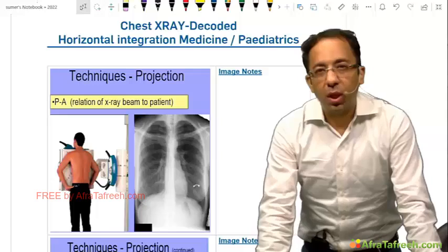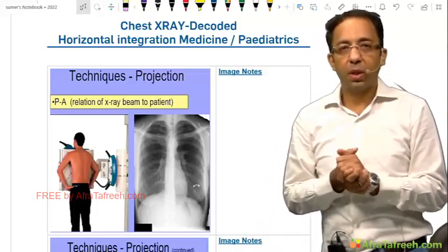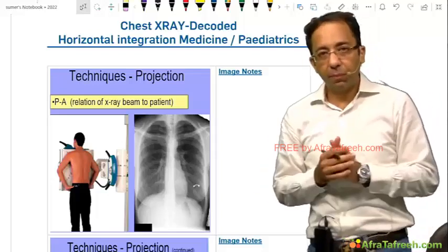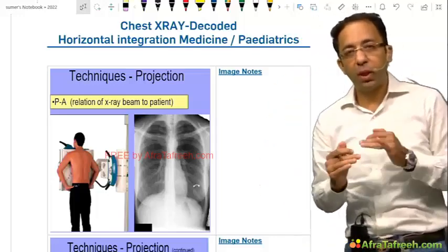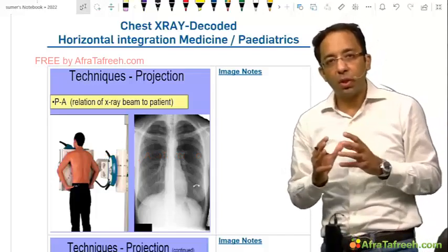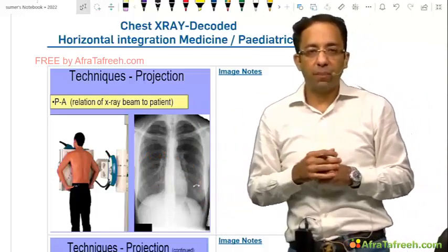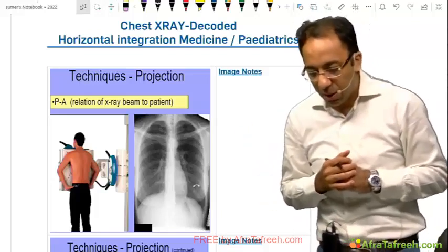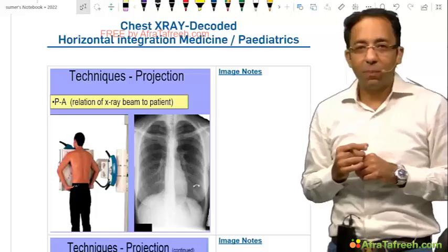Now I'm going to talk about one of the most important topics of radiology for an MBBS graduate, both clinically as well as for your practical life. I'll try to go very basic, from the smallest possible thing to the toughest things. Again we will gradually do the technology, the technique, the anatomy, and the diseases. That will be my approach in chest X-ray. I'll look at the pulmonary diseases as well as cardiac diseases. Everybody gets it?